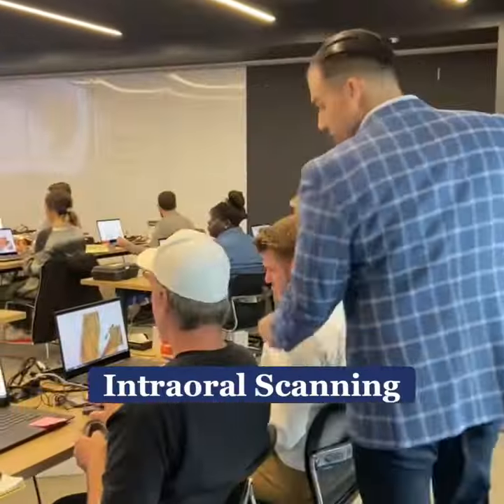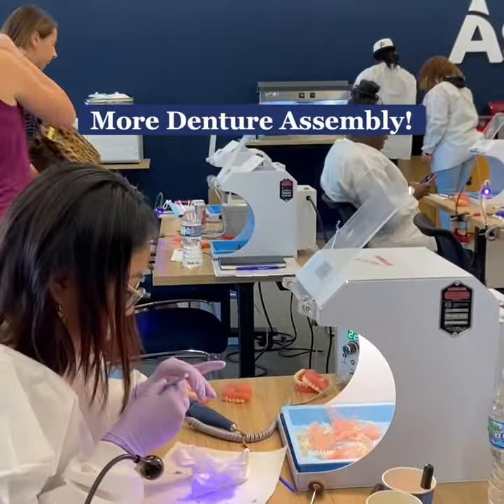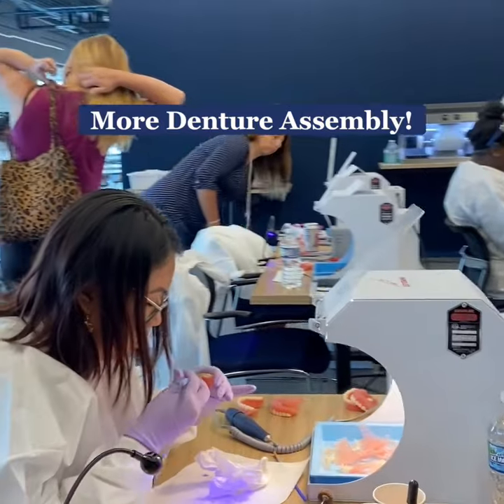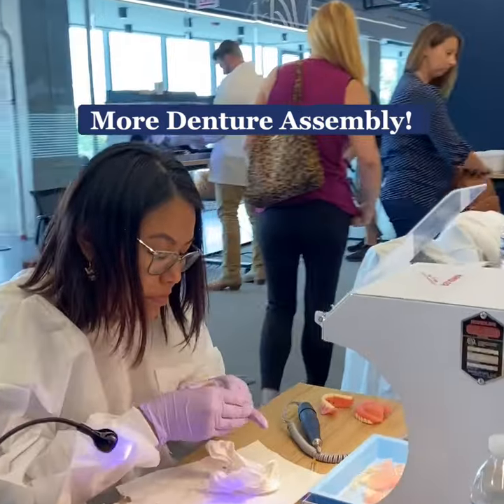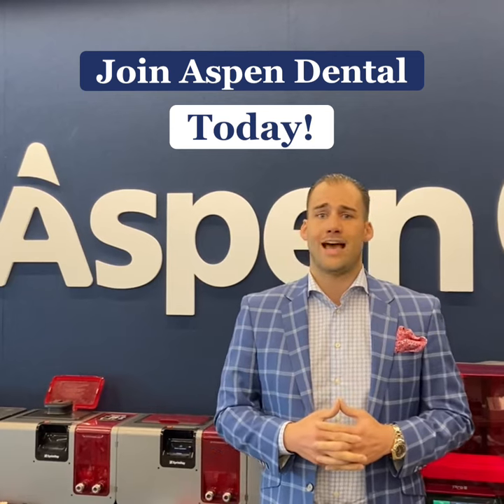Now I want to bring you into this room where we're doing the scan portion of our Print Assembly Scan System. Come on in. That's how we're changing the lives of our dental technicians and creating an amazing career path and growth for them right here in our own organization at the Aspen Group.